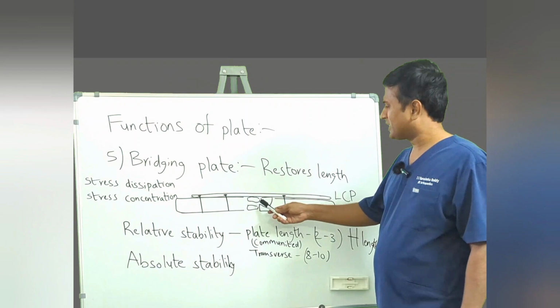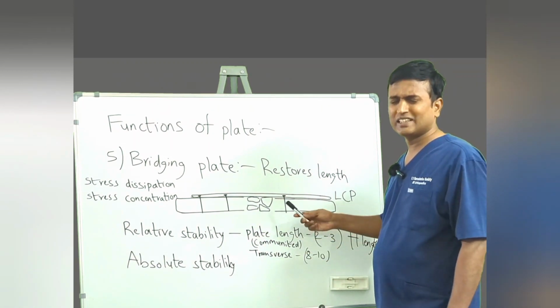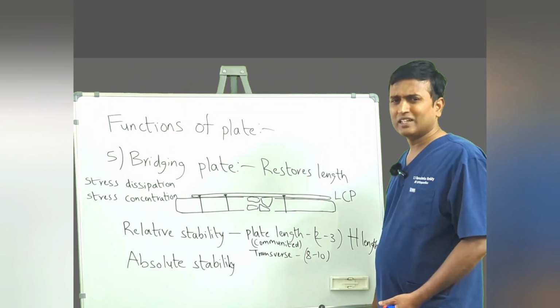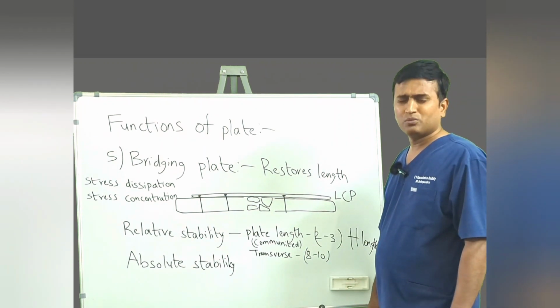And if it is only a transverse fracture, then how much should the length of the LCP plate be? It should be around 8 to 10 times. I hope that should be useful.